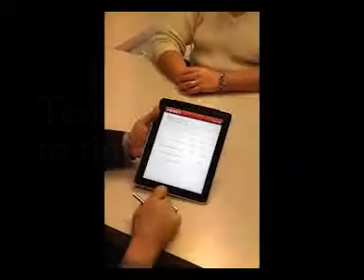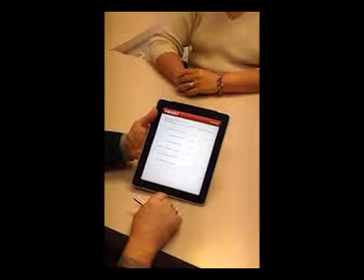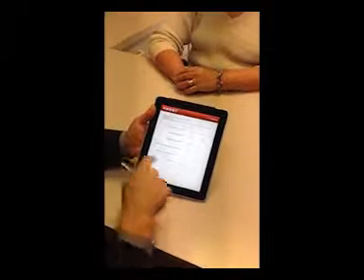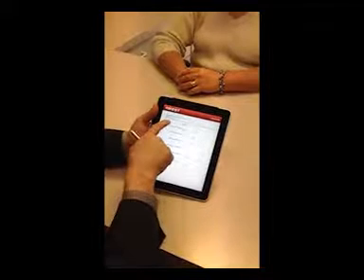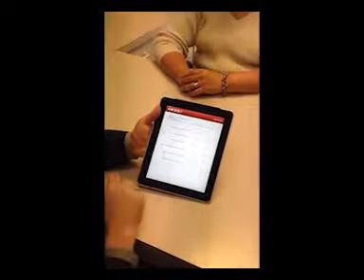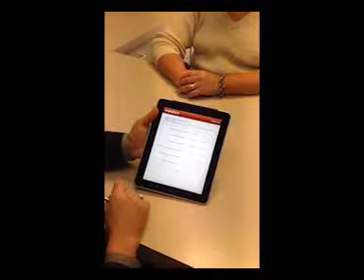After registering 3 words, we're going to ask Julie what today's date is, because orientation is an important feature of cognition. You'll see at the top that we've locked in what today's actual date is, along with the season and the time, with a half an hour on either direction, so that you're able to easily see what's an acceptable answer. Julie, what's today's date?